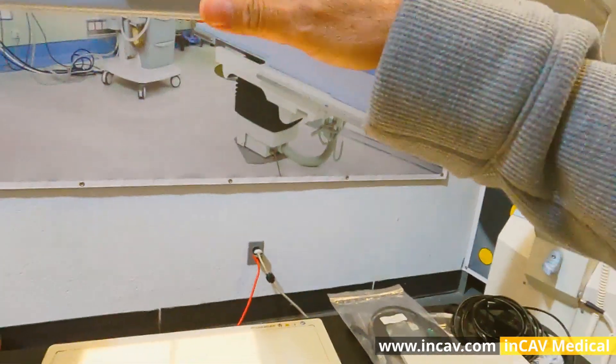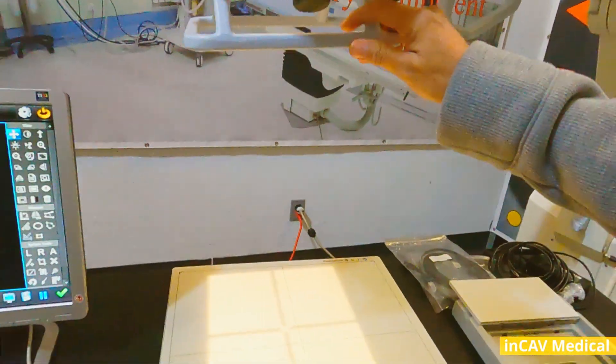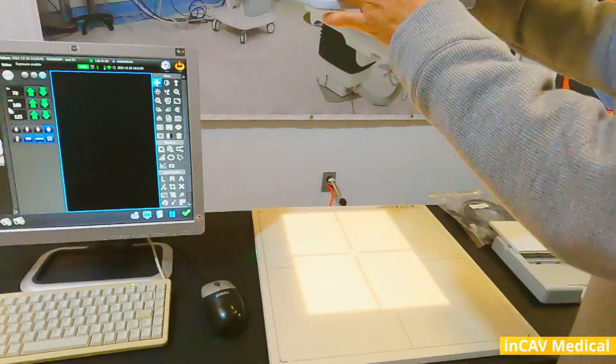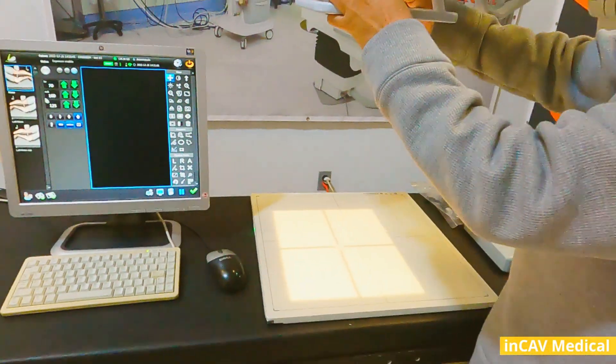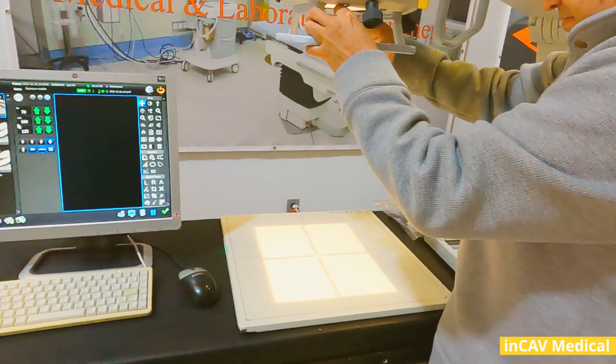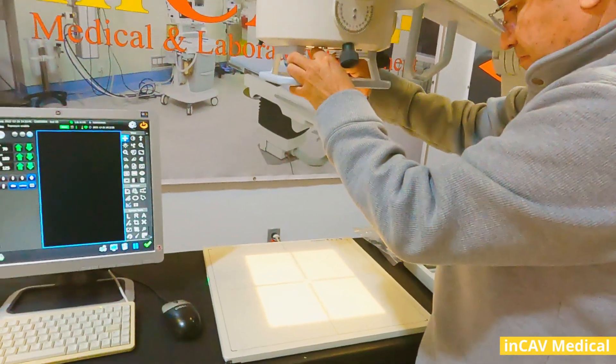In this case, we are going to use Siemens Mobilet Portable, also for sale here in InCAV Medical.